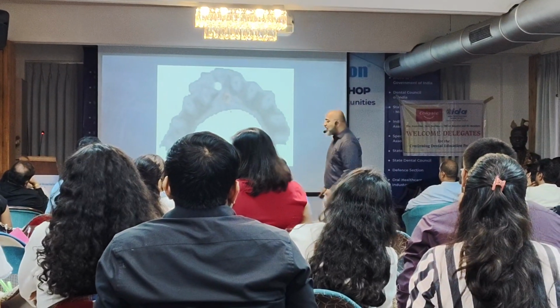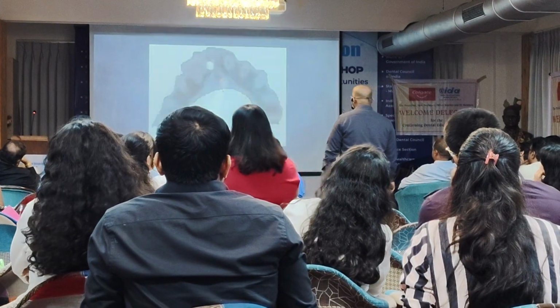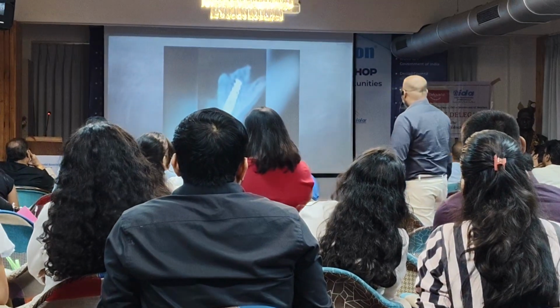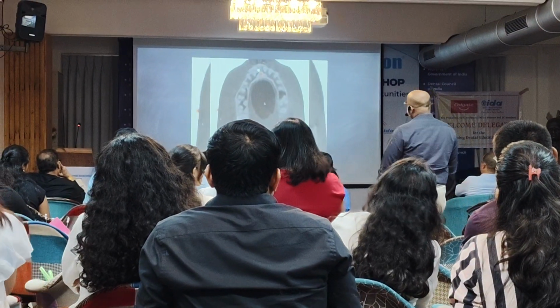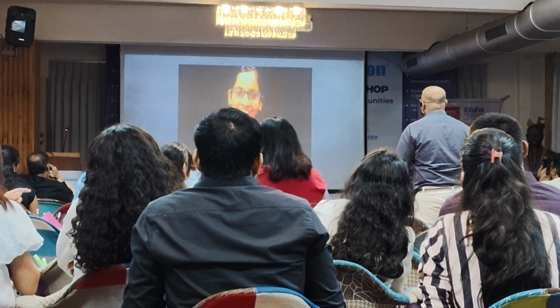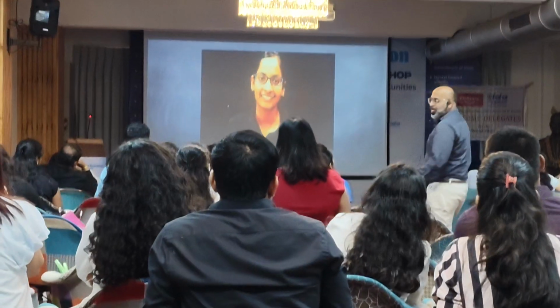After doing the GBR, this CBCT goes 3 months. This CBCT goes 6 months. This is how we would restore it in a year's time.